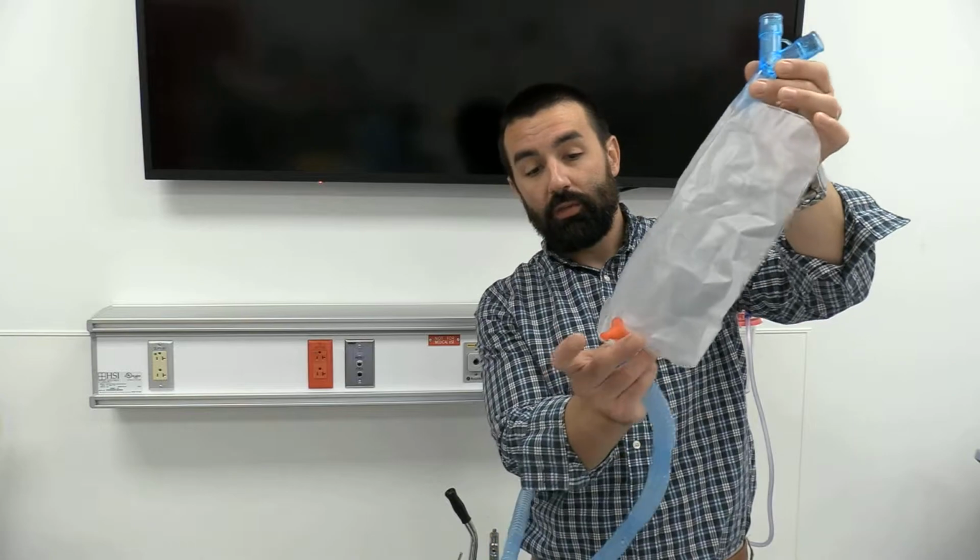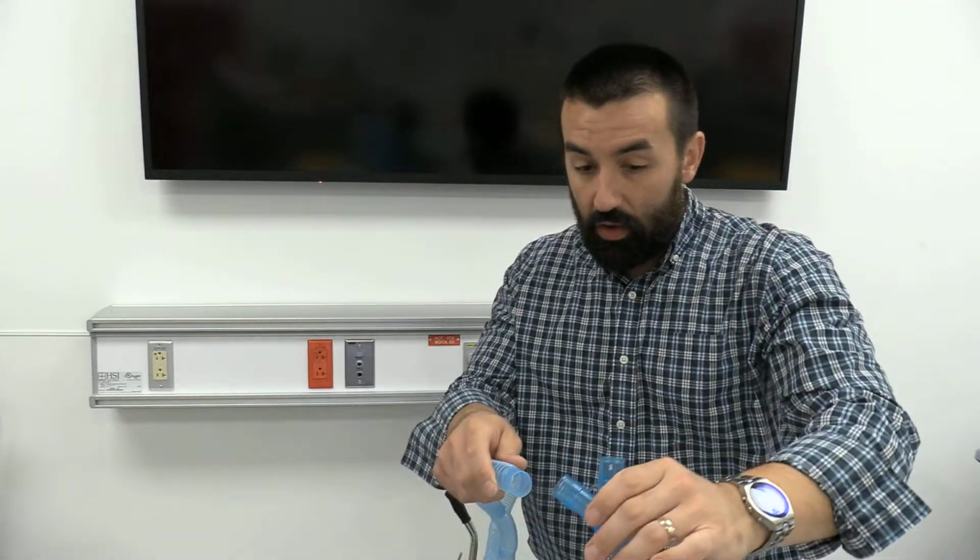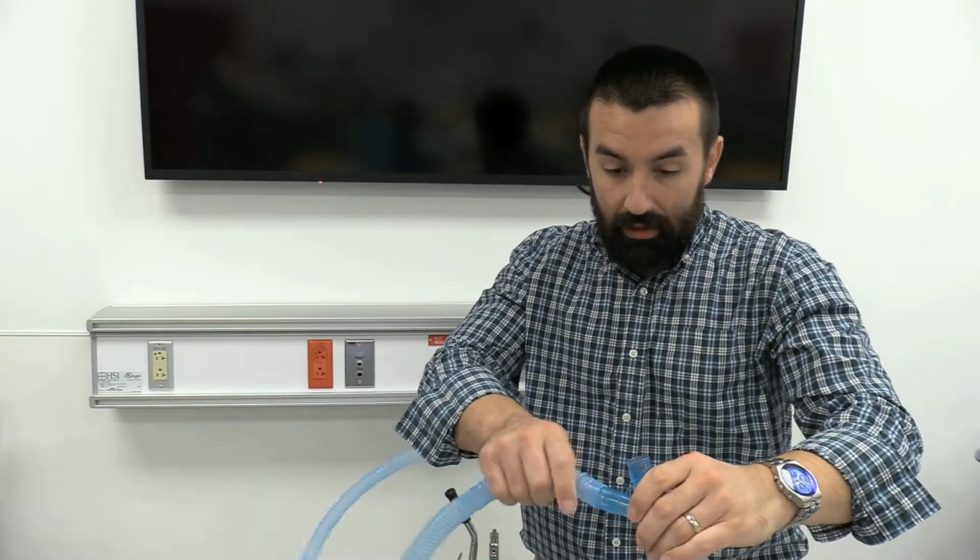So the reason we need 2 lengths of tubing is because we're going to take a drain bag, okay? I will tell you, make sure these drain bags are closed. This is a pretty large one. They come in different sizes, okay? So once I get that closed, it's going to go into this Y on one end.